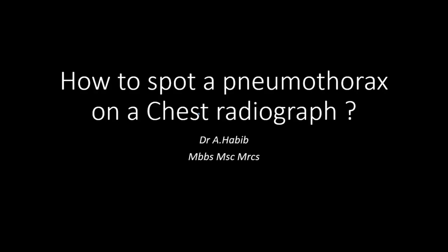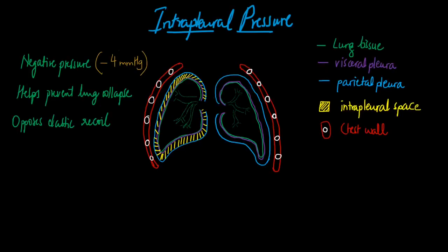Today we'll learn about reading the signs of a pneumothorax on a chest x-ray. Before looking at the x-rays, let's have a brief look at the lung physiology. This will help you understand the pathogenesis of a pneumothorax.